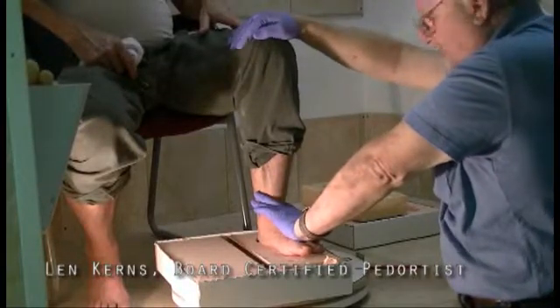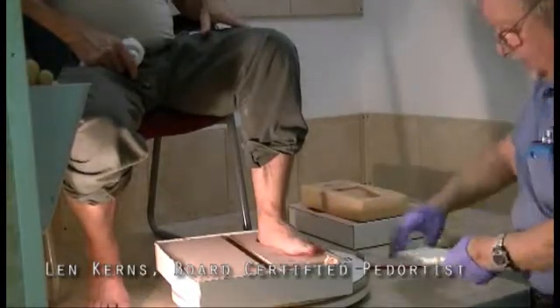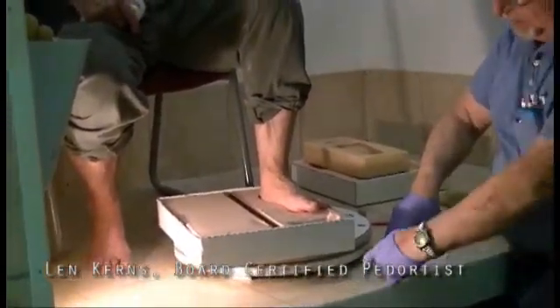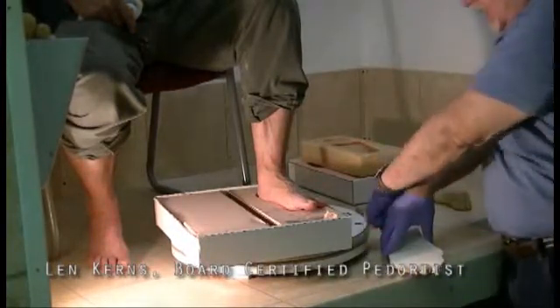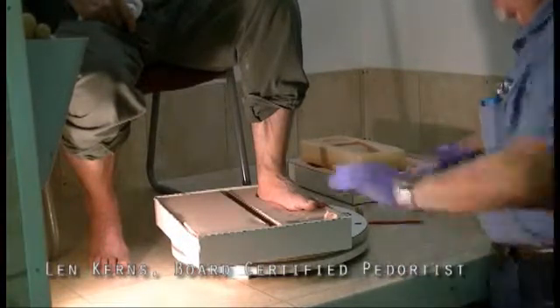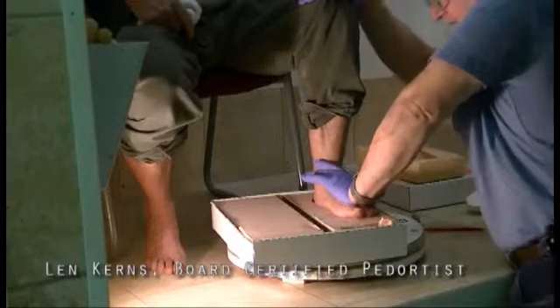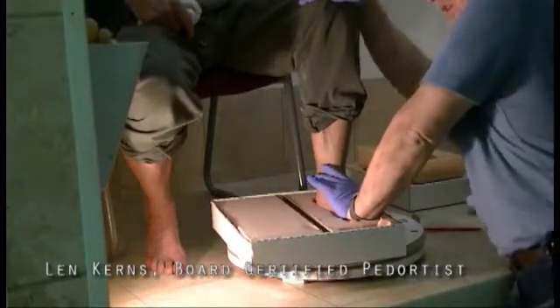The whole secret right now is to get this heel, which is already at the bottom of the box, and you want to push this foot down, down, down, until the fifth hits the bottom of the box, and therefore you'll have the fifth metatarsal and the heel on a level plane, the same as it would if you were casting in plaster. So I am going to push all 5 heads, holding the angle that it is right now, straight down until I feel the fifth.